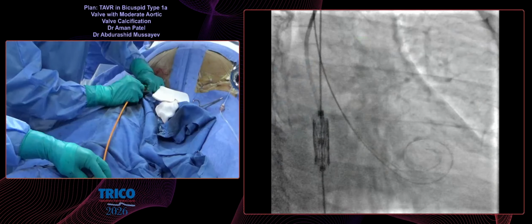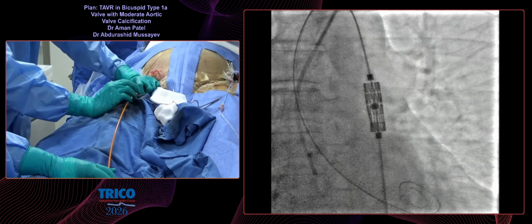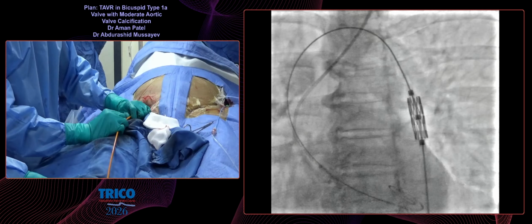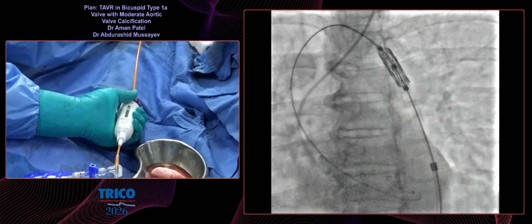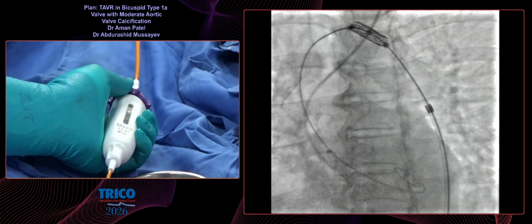Okay, now show the aortic arch, go to LAO. In this navigator system in my valve, we have the ability to flex the sheath. So when we are going across the aortic arch, show here. How much do you flex? Half? Yes, half. Sometimes we don't use it. Here it is not necessary to use.